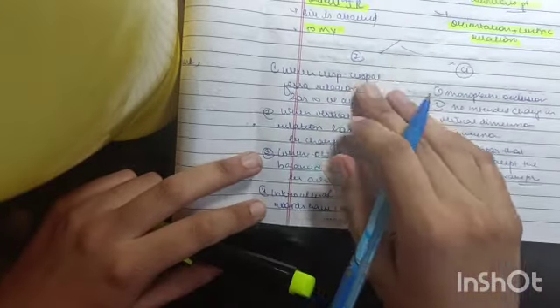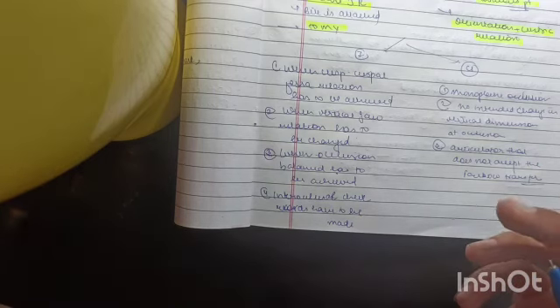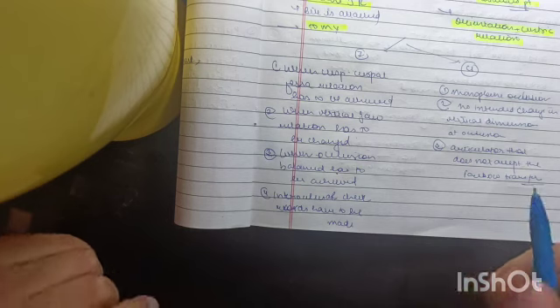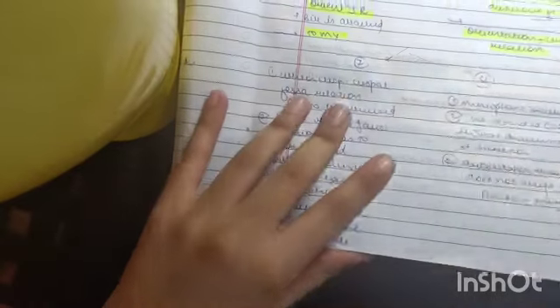Then indication: when we have to get the proper occlusion with cusp and cusp fossa relation. Then when vertical jaw relation, vertical dimension at occlusion has to be changed. Also when we have to achieve balanced occlusion, and intraocclusal check records have to be checked. Now contraindicated when there is monoplane occlusion and no intended change in the vertical dimension at occlusion, and articulator that does not accept the face bow transfer, that is class 1 and class 2 type of articulators.